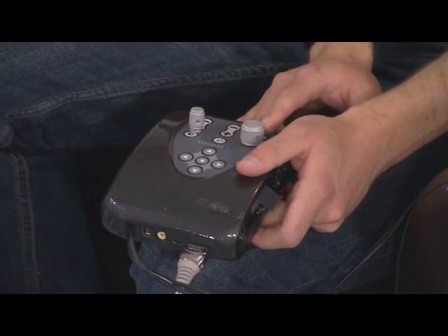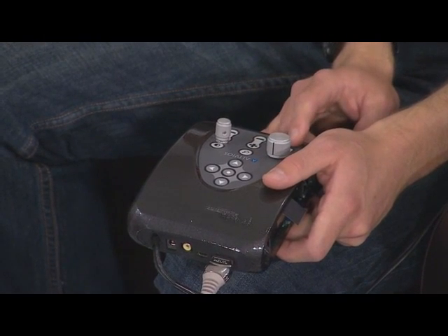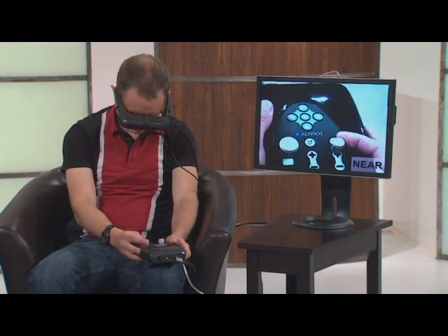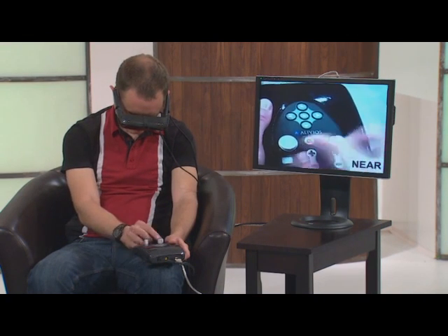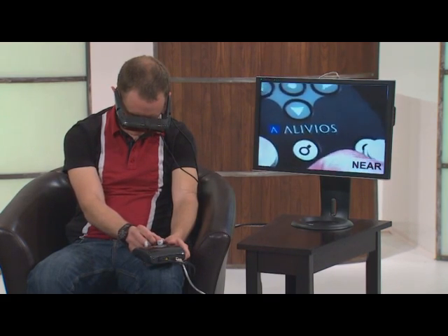One knob is for controlling the camera, and that's typically done for controlling zoom and focus operations. And on the right is a knob for contrast. So as Jonathan turns that, you'll notice, if you can pick it up on the other monitor, the sharpness of the image becomes greater as he turns that knob. And we're seeing exactly what Jonathan's seeing right now, correct? Pretty much, yeah, that's right. Amazing. That's amazing. It's neat.